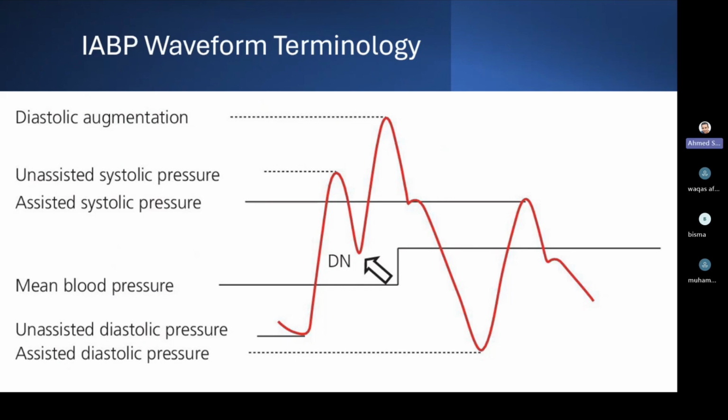That's why, if you are discussing the intra-aortic balloon, you should know the cardiac cycle and the timing, and which valve is opening during the systole and which during the diastole. The aortic valve will open when, and close when. The mitral valve will open at which time, right? So the physiology behind the intra-aortic balloon is very essential. You have to know the timing of the cardiac cycle.